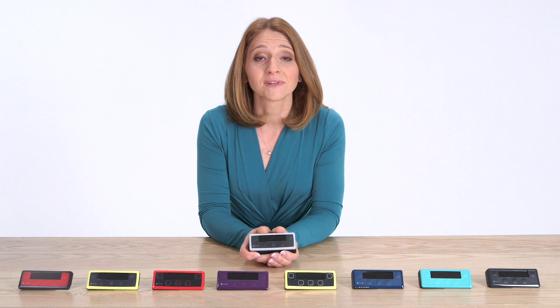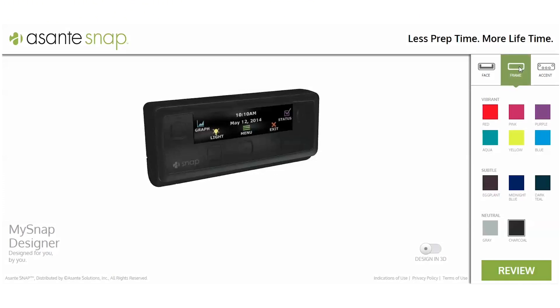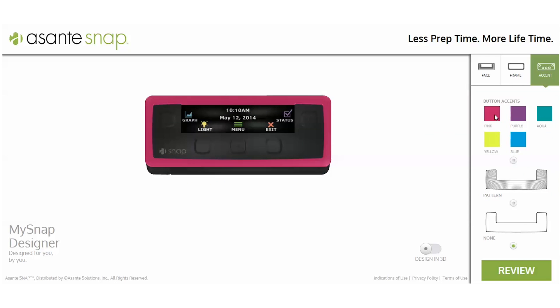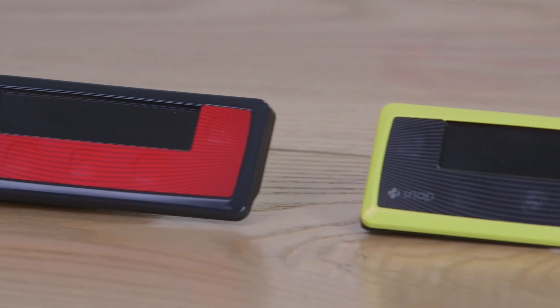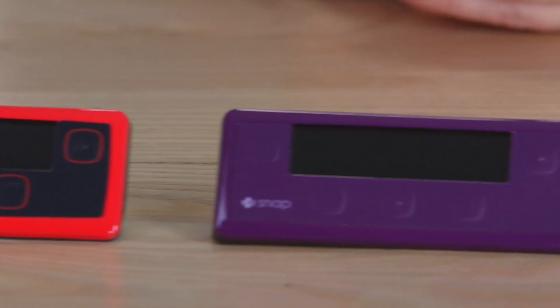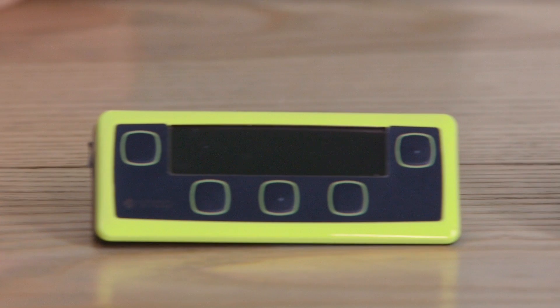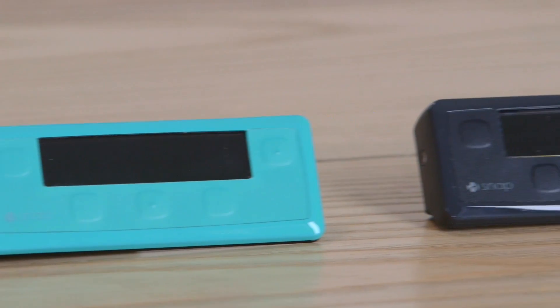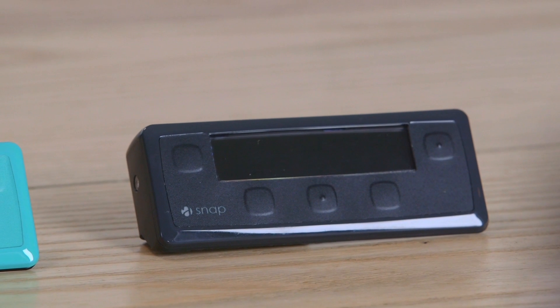Only SNAP lets you choose the look of your pump to fit your unique style. You can choose your color in three simple steps at snappump.com. Each pump is made to order right here in Silicon Valley. Here are just a few samples of what your customized pump could look like — there are literally hundreds of combinations that you can make your very own. Design your pump today at snappump.com.